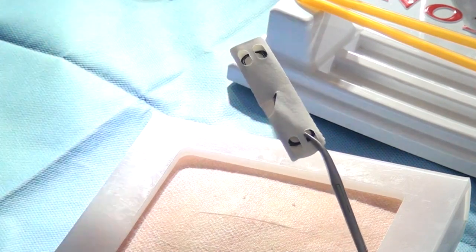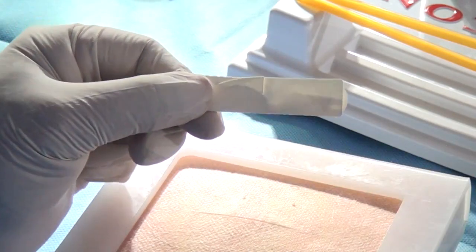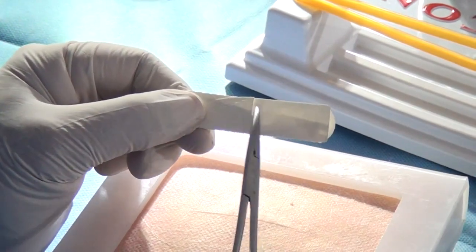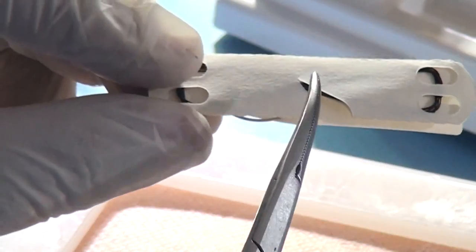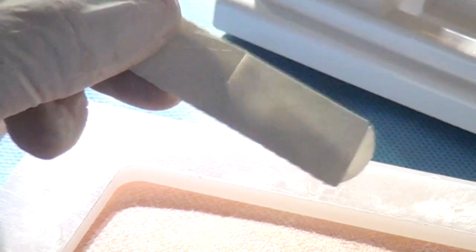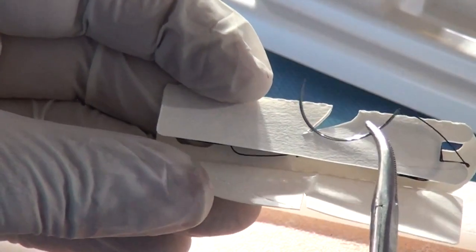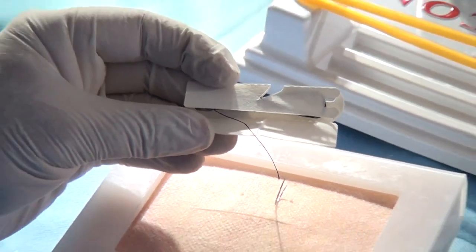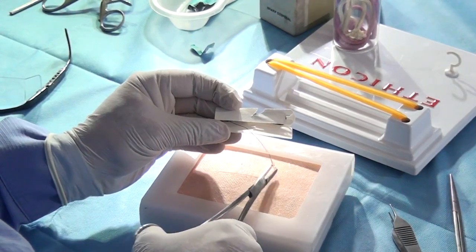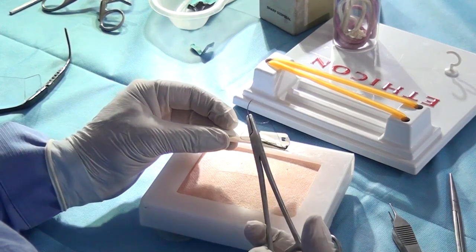The next step now, again, there is a vertical slit, seen or not? Yes, sir. Here, okay, that's vertical, and there's an oblique cut here. Remember, the straight cut is where the needle is. So that's why the cuts have been provided, they're not for no reason. I hold on the needle. Where do I hold the needle? At the junction of posterior 1/3 and anterior 2/3.